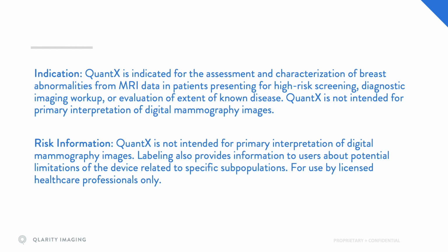Indication. QuantX is indicated for the assessment and characterization of breast abnormalities from MRI data in patients presenting for high-risk screening, diagnostic imaging workup, or evaluation of extent of known disease. QuantX is not intended for primary interpretation of digital mammography images. Labeling also provides information to users about potential limitation of the device related to specific subpopulations for use by licensed healthcare professionals only.